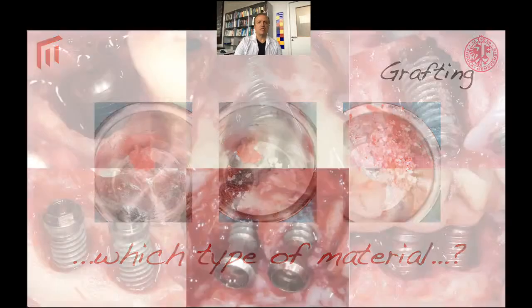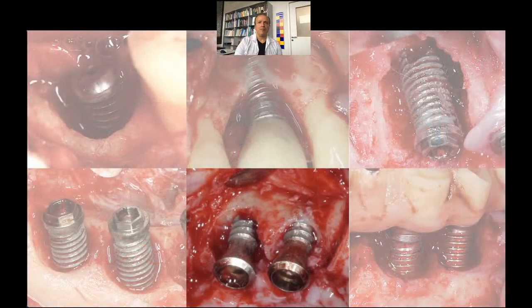What is important is that you do not overfill the defects. We want to use the graft just to support the blood clot and give some stability to the system during the early phases of healing. You do not need to really fill up the defect space, because in this way you eliminate space for new tissue formation.